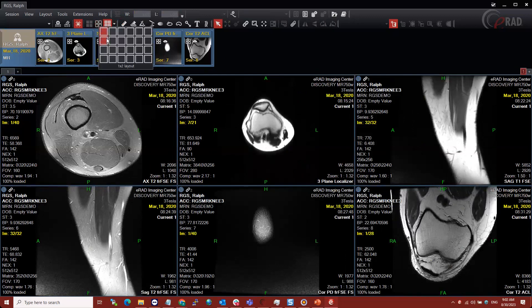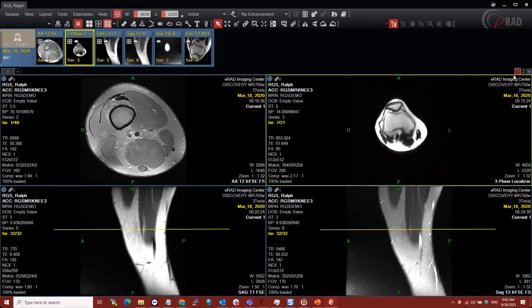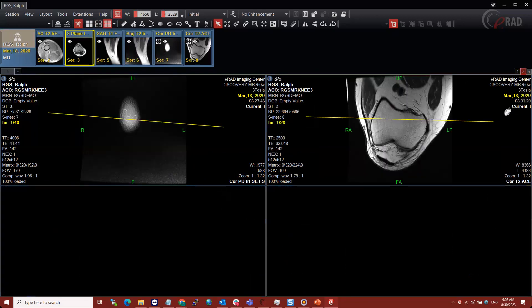When I go back to a 4 on 1 layout, I've got fewer frames than I have series. I only have one monitor, so I've got one viewer window. Whenever I have more frames than I can see and I have it on selected study or all studies, it's going to add an extra virtual monitor at the upper right-hand corner — you'll see tabs labeled one and two. So when you're building hanging protocols at home with one monitor, you can still build protocols that use multiple virtual monitors for use in the office.